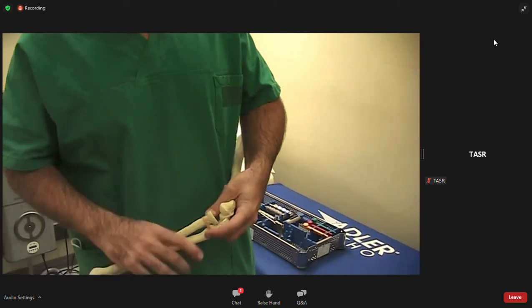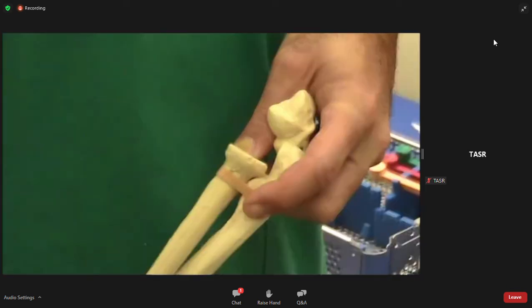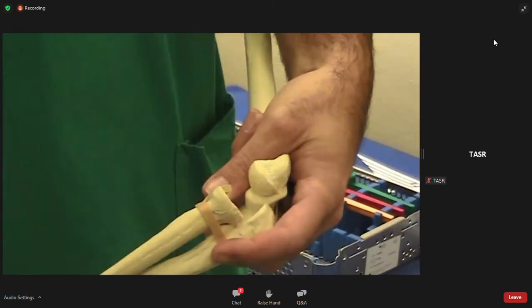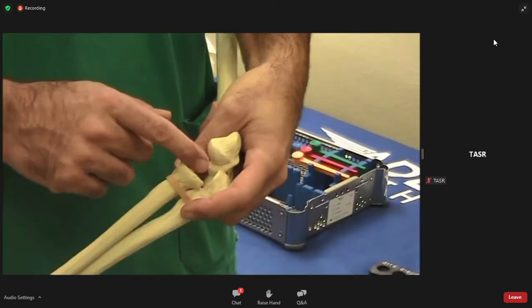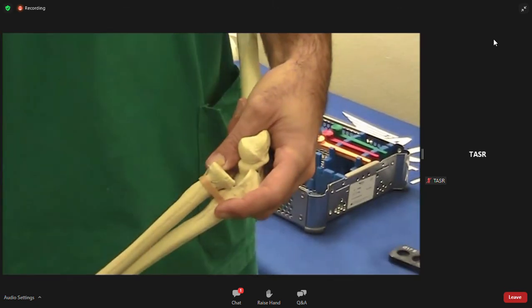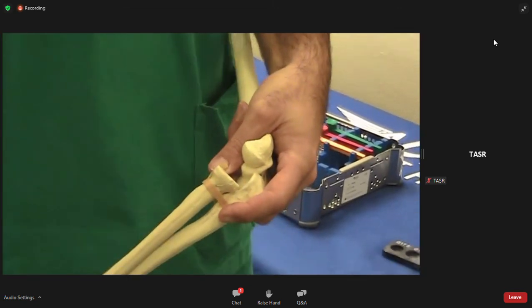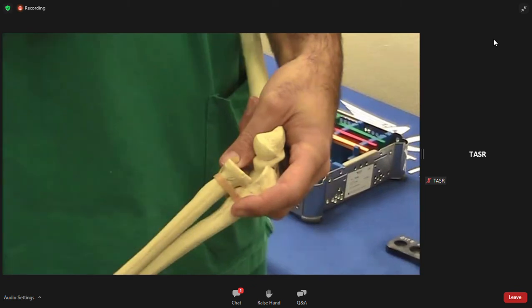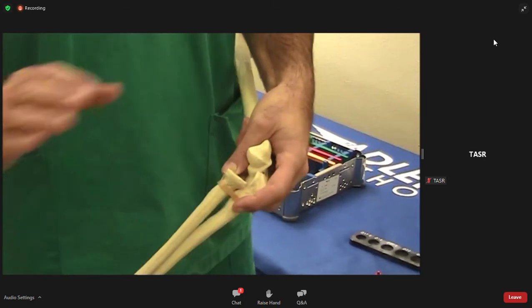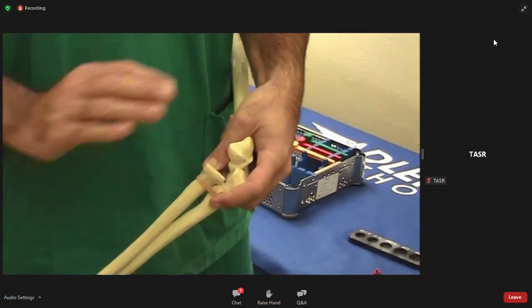You are on a table normally with brachial plexus anesthesia, so the joint is like this. So never try to measure in this way, and never use the height of the prosthesis to compensate a joint instability. That's a super important rule. If you do that, you're gonna have a stiff elbow, painful elbow, so please don't do that.